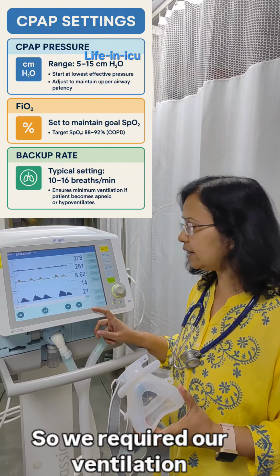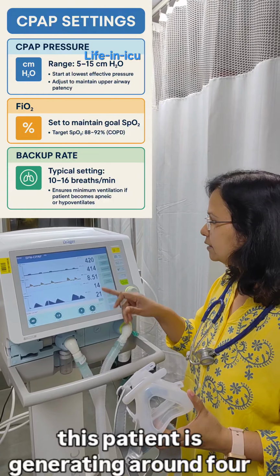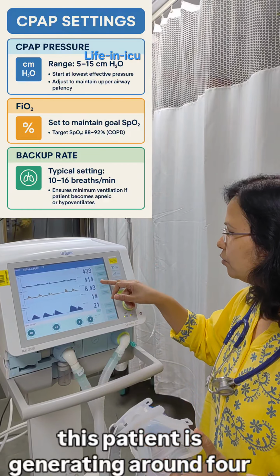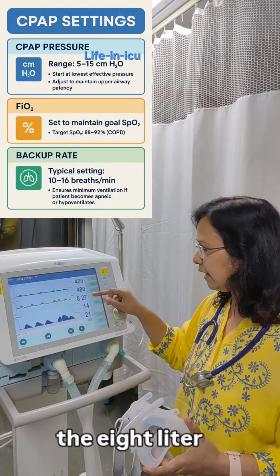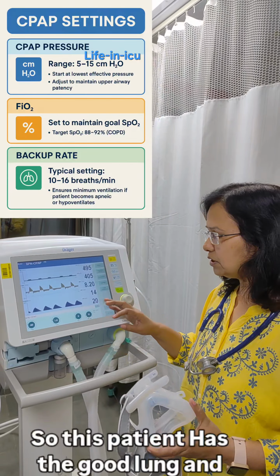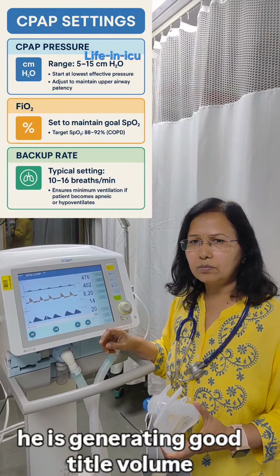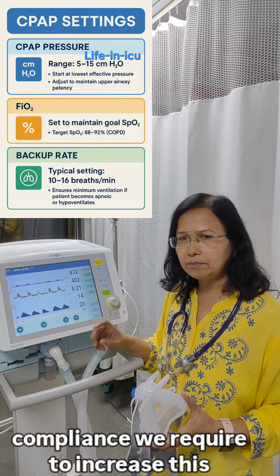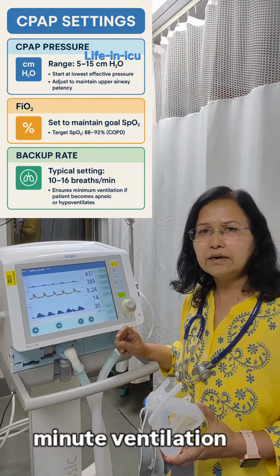So we require our minute ventilation. If with a pressure support of 8, this patient is generating around 400 tidal volume, then our minute ventilation here is 8 liters. So this pressure support is okay with us. This patient has good lungs and is generating good tidal volume. If the patient has bad lungs or bad compliance, we need to increase this pressure support to get the same minute ventilation.